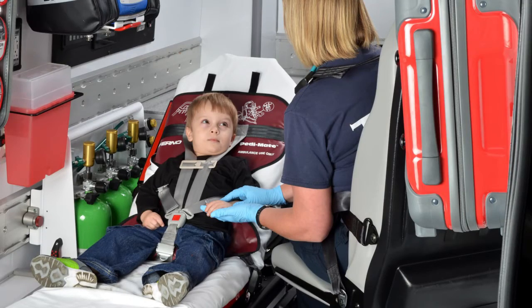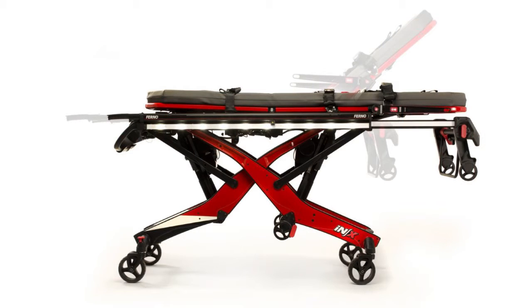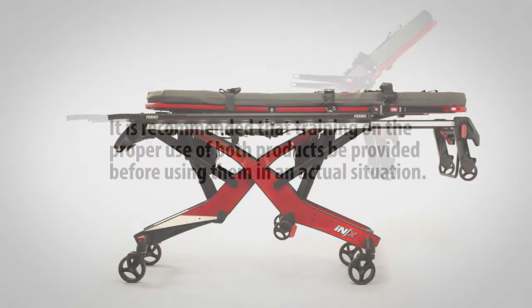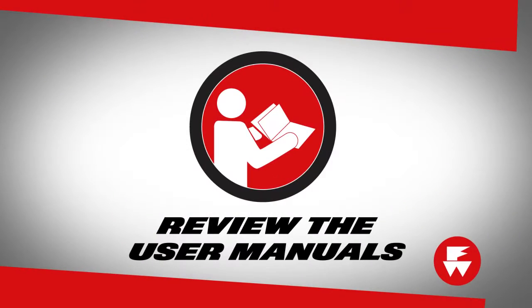This video describes how to attach the FERNO PDMATE to the NX Integrated Patient Transport and Loading System. It is recommended that training on the proper use of both products be provided before using them in an actual situation. Carefully review the user's manuals for both the PDMATE and NX for complete instructions on the use and care of each product.